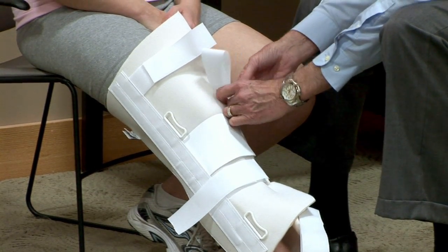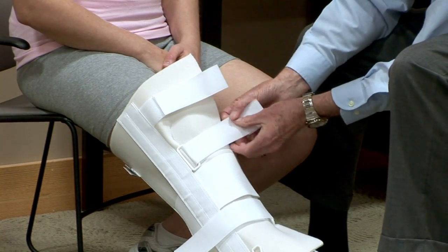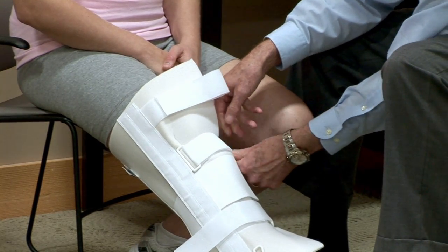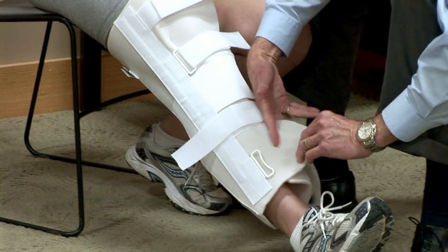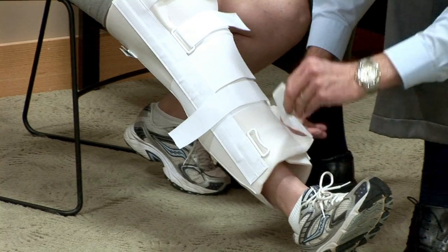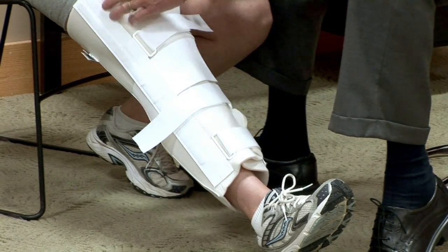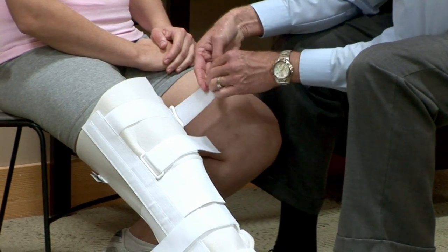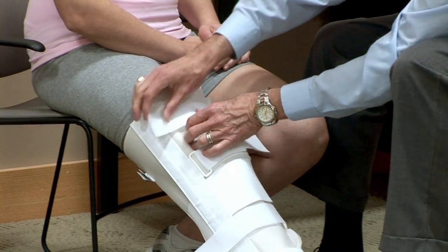I like to do the strap immediately below the knee first, then above the knee, and adjust the length of that strap. Then we'll do the distal one. Here I have excess foam — you would actually just take the scissors and cut that off. Then do that strap, the proximal strap, and adjust the length of that. I could trim that strap off as well.